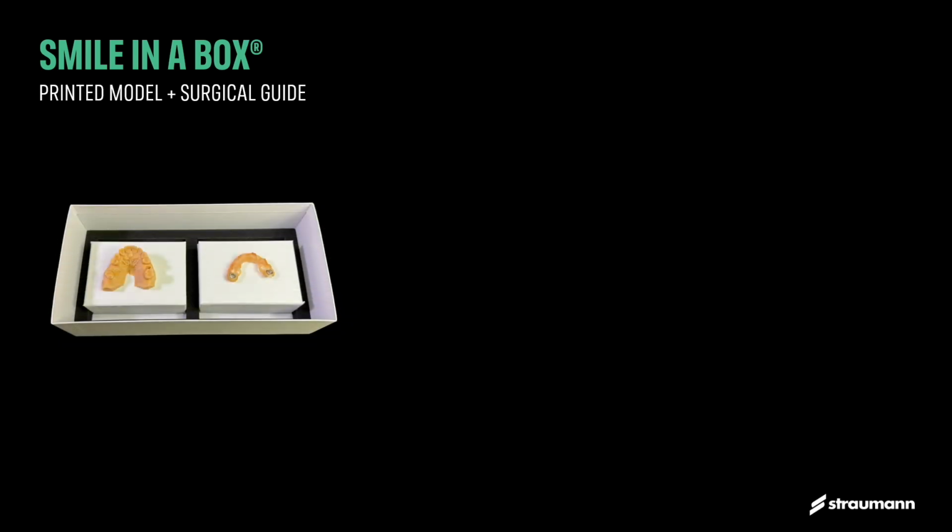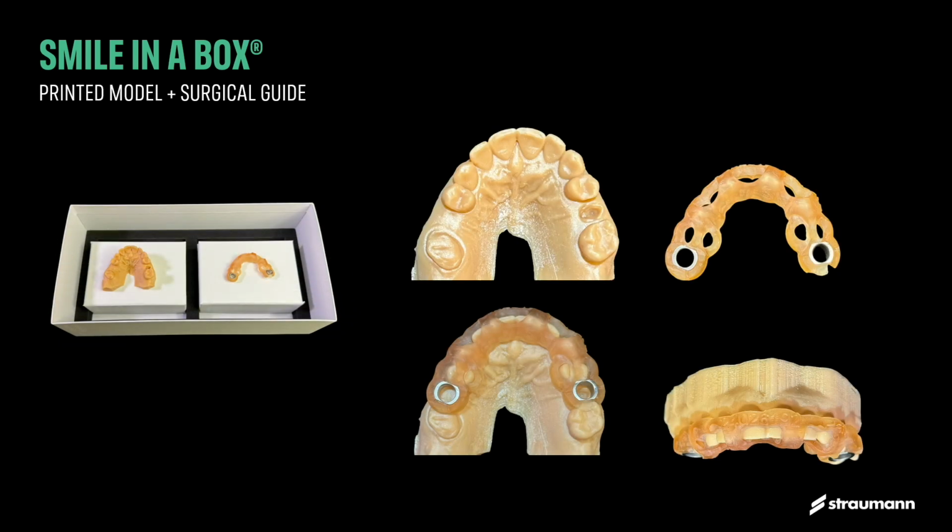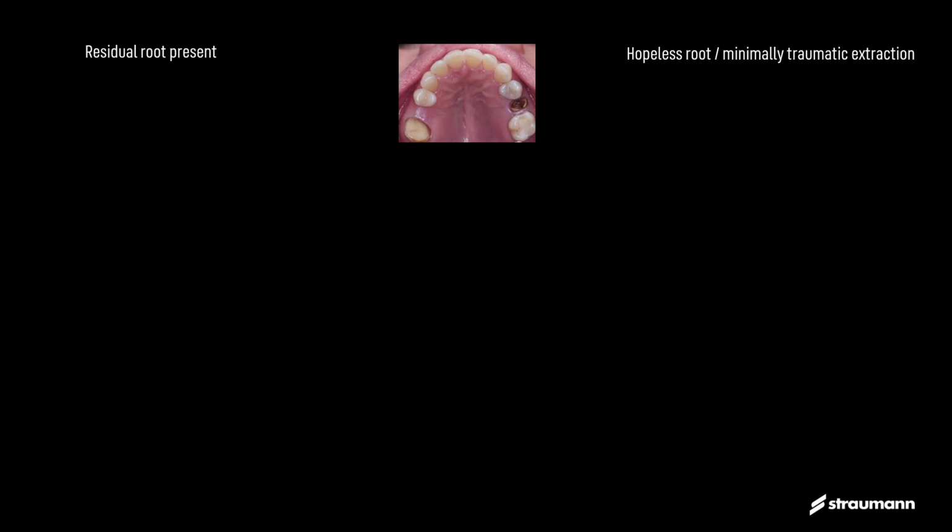Now let's get practical. We also opened the box. I ordered the model and I ordered the guide. The reason I ordered the model is exactly to see if what I wanted to check in regards of guided surgery fits the model, if there will be any interference during the surgery that I need to be aware of, that I need to work on so the guide fits precisely. So I checked, and here is how the surgery took place.